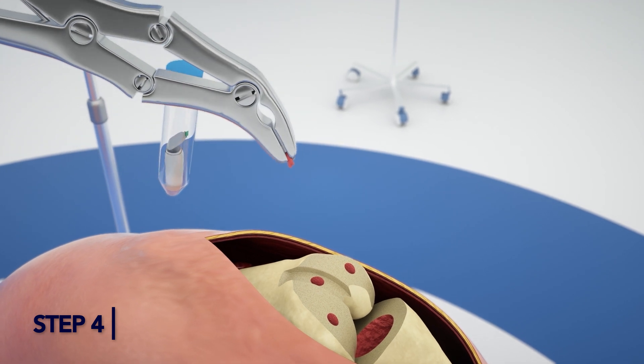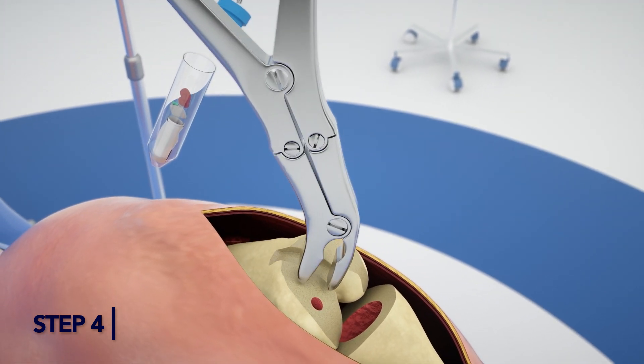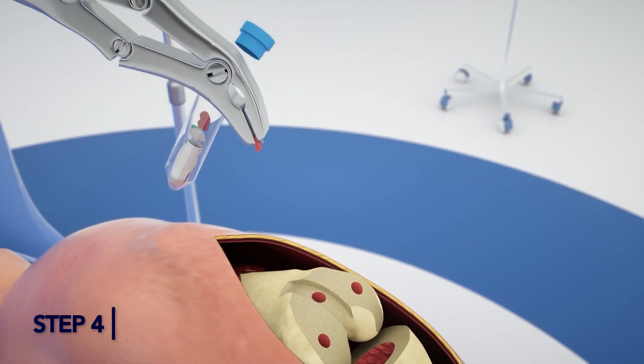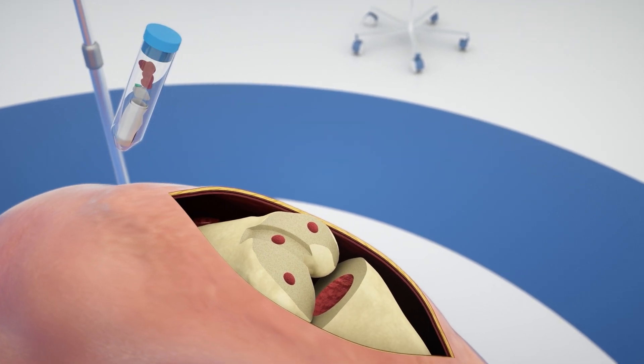Step 4: Collecting a Tissue Sample. Using a clean rongeur, or appropriate surgical instrument, remove a small pea-size amount of tissue from regions of the joint where infection is suspected. Deposit this into the same 50ml vial used in Steps 1 and 2.